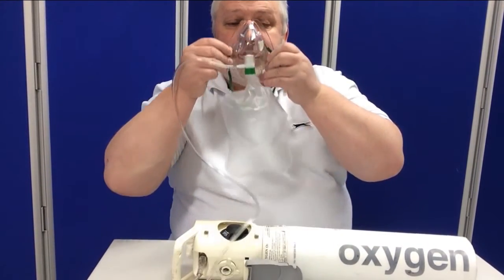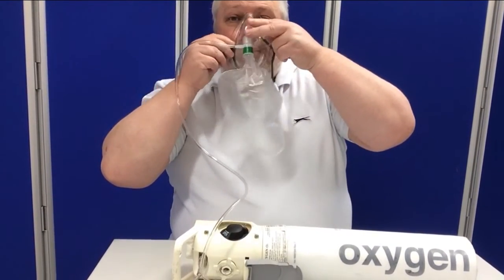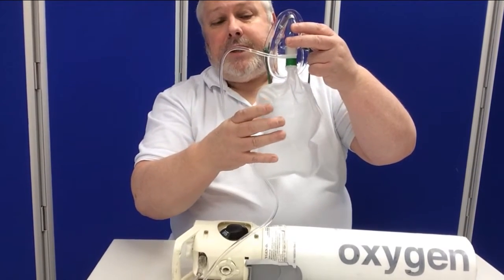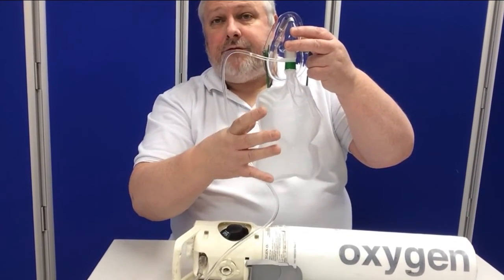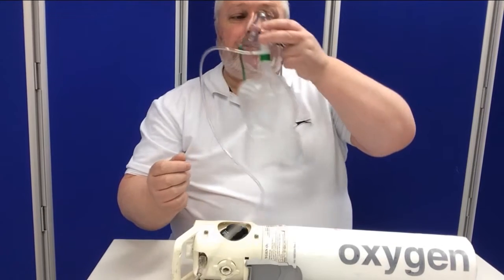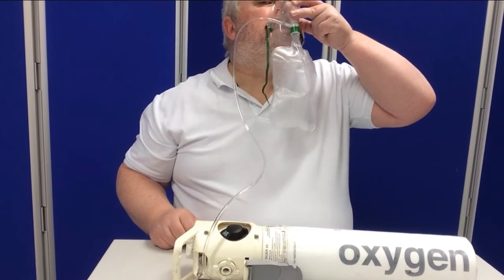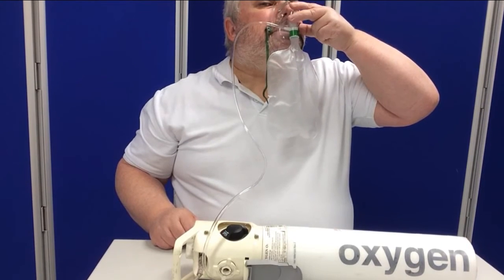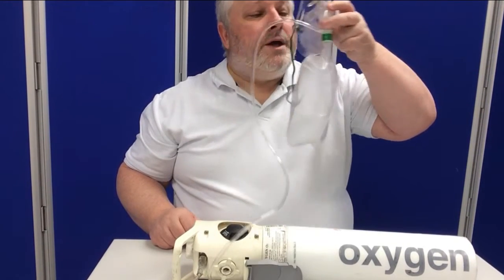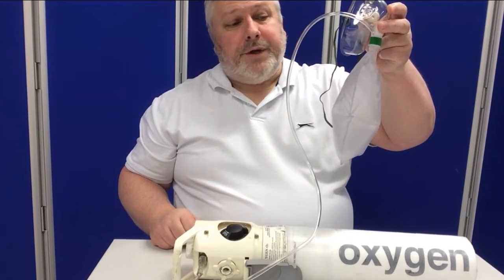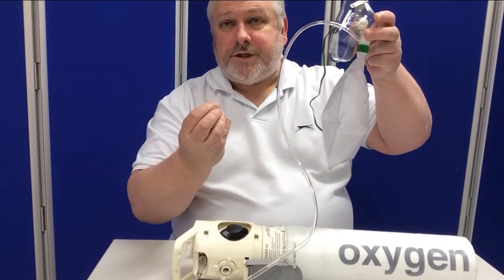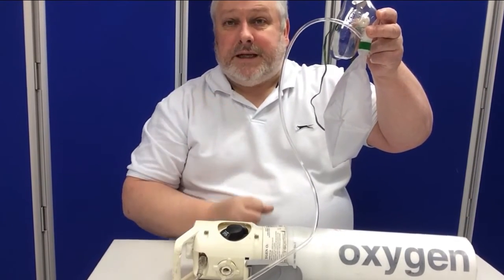When you place it on the patient and the patient breathes, you'll see that the bag deflates and then re-inflates with oxygen. The ideal flow rate for the patient will be where the bag moves but does not get completely empty.